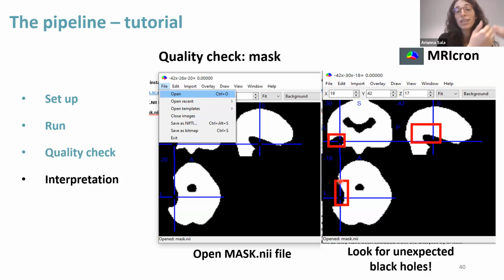So here you don't see a statistical effect just because this area was excluded from the analysis, not because there is no effect. Actually, this area has a very, very, very huge hypometabolism, so huge that it doesn't even look like we are analyzing gray matter.